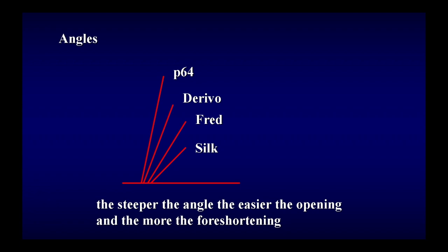This is very important. You can play with the size of the flow diverter if you want it shorter or longer. And usually, if it's short, all the struts will close more. So if you have perforators, it is better to oversize the stent, meaning in a 3 millimeter artery, use a 4 millimeter stent. It will stay longer, but the struts will be more open. So in the middle cerebral artery with all perforators, in the basilar artery with all the perforators, it is better to oversize the stent, in my experience.